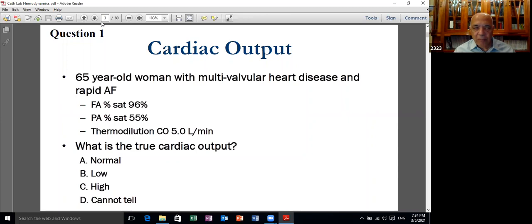By the way, we don't measure the cardiac output. We calculate the cardiac output. There is no method, even in experimental animals, with putting a magnetic probe around the root of the aorta, which is the most precise method. You still calculate the cardiac output. And you calculate the cardiac output by whatever method. It depends on the Fick principle. Even the thermodilution depends on the Fick principle.